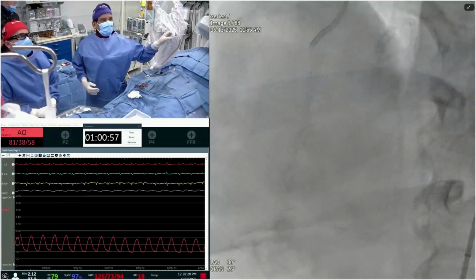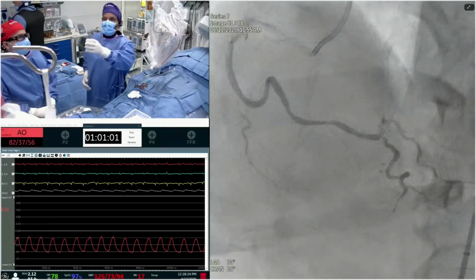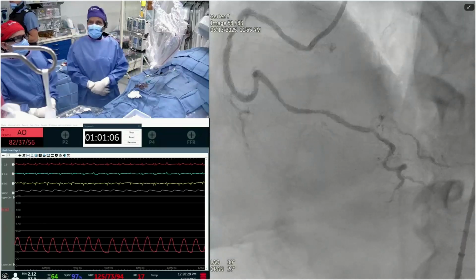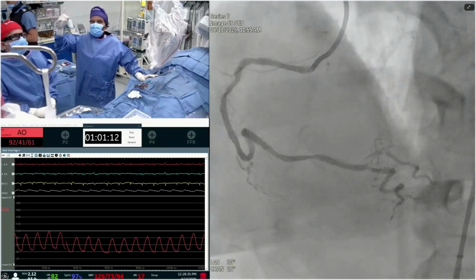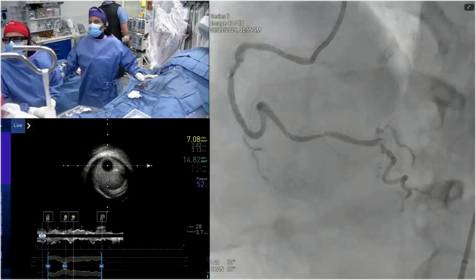Since we have done three cases of rotational atherectomy, the orbital atherectomy team called us, asking how can we not do OA? So we said this case is a good case for OA. But before that, we showed the IVUS. How do you like that? IVUS before the atherectomy. Sure, all right.